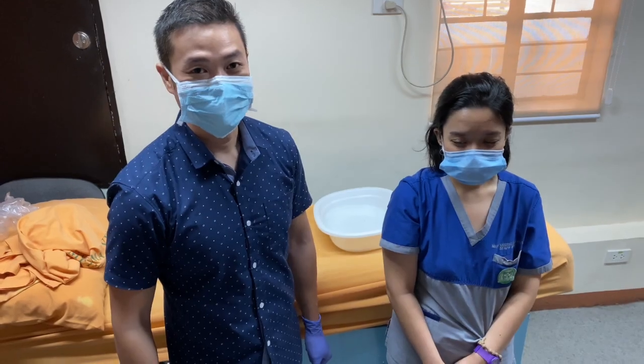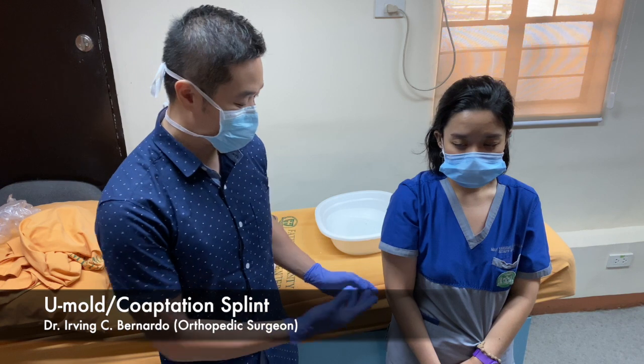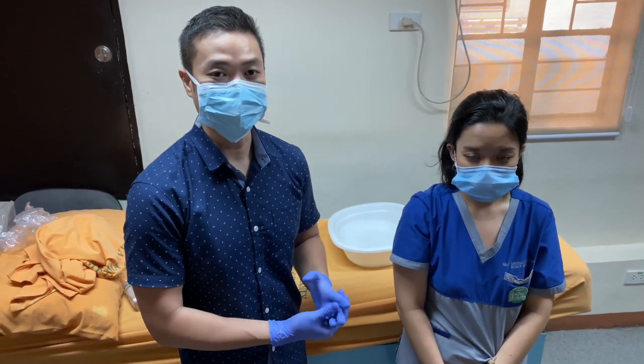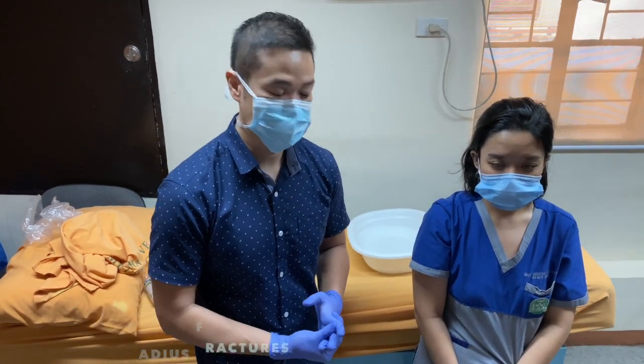We are demonstrating the procedure on how to make a U-mold — the U-mold on the forearm. You use this type of mold particularly for radius and ulna fractures, which are commonly seen in the emergency room.